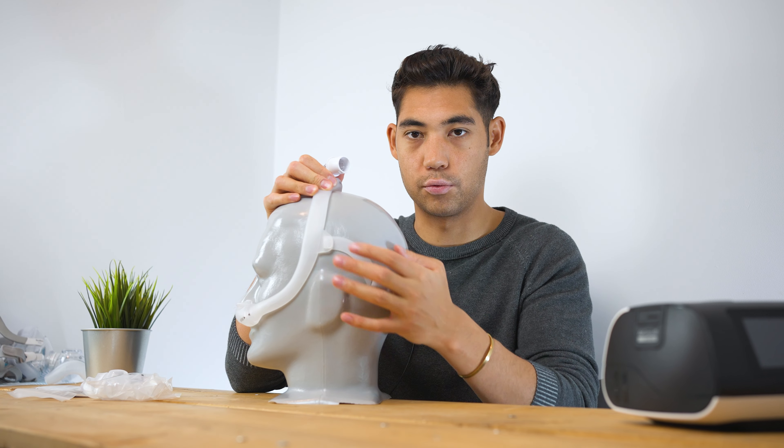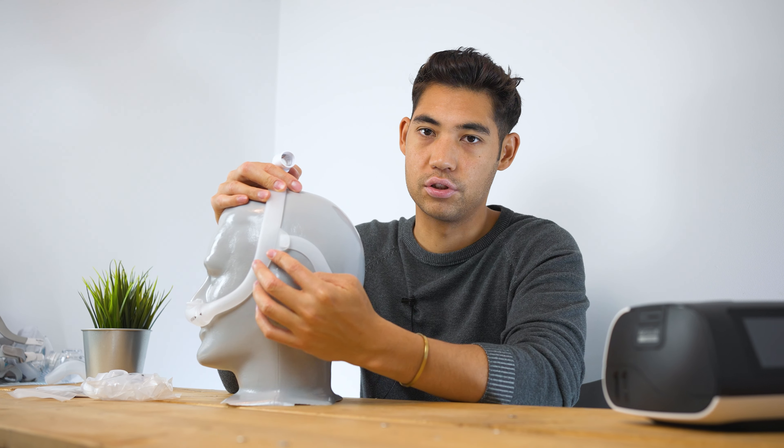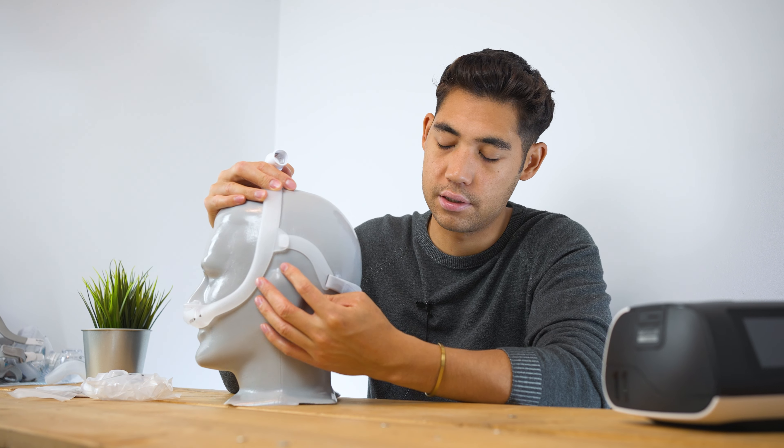Whereas if you had a front-mounted mask and you have your nightmares, it starts to tangle up and choke you. So that's why a lot of people, especially if you move around, should definitely consider a hollow frame top-mounted mask.